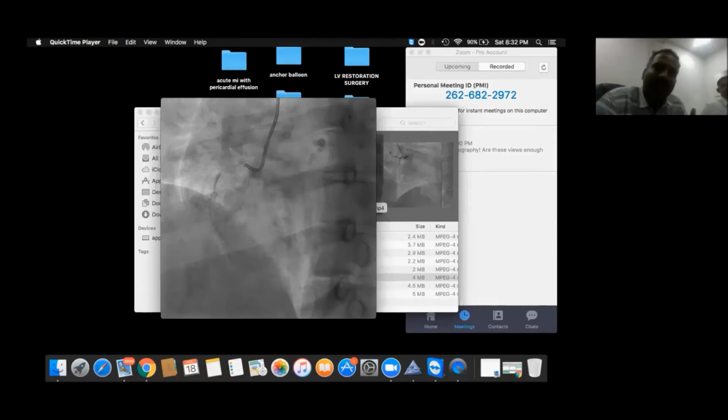Okay, sir. MPA catheter, and the view for left grafts is the RAO view. Left graft is exactly on the anterior aspect of the left sinus. So come to an RAO view, and try to pull your catheter, tilting it anteriorly. That is your MPA, and pull it back slowly.